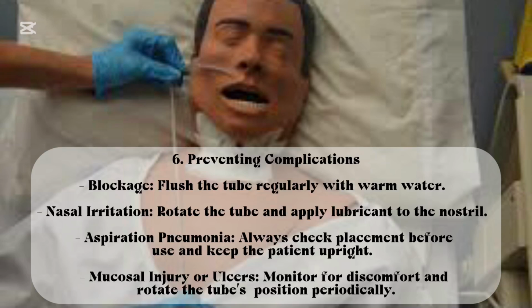6. Preventing complications. Blockage: flush the tube regularly with warm water. Nasal irritation: rotate the tube and apply lubricant to the nostril. Aspiration pneumonia: always check placement before use and keep the patient upright. Mucosal injury or ulcers: monitor for discomfort.